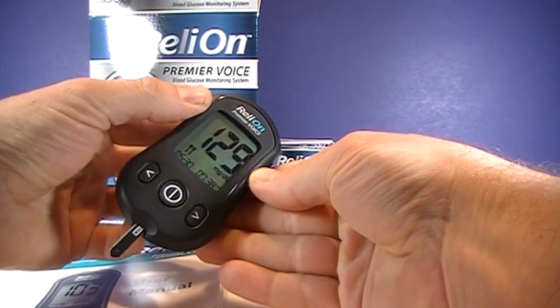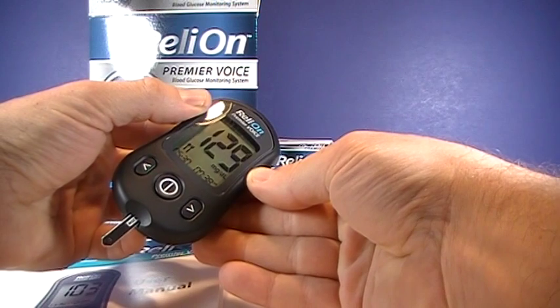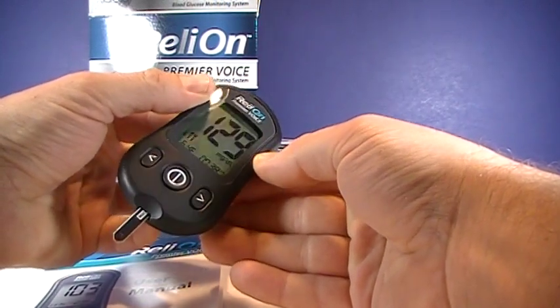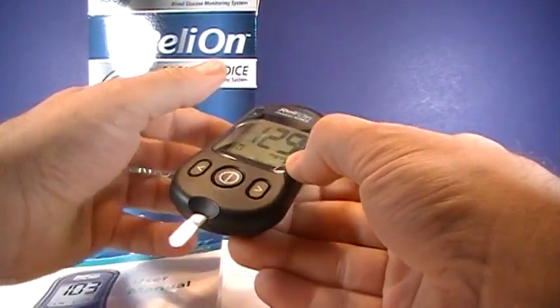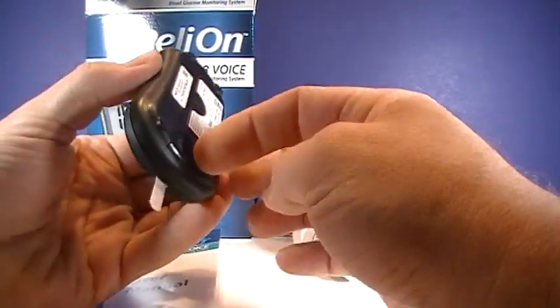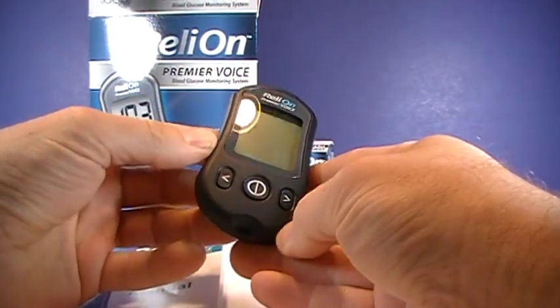Your blood glucose reading is 129 milligrams per deciliter. I just ate about 15 minutes ago — a piece of cake, actually. Then you can use the ejector, which removes the test strip, and the meter turns off.